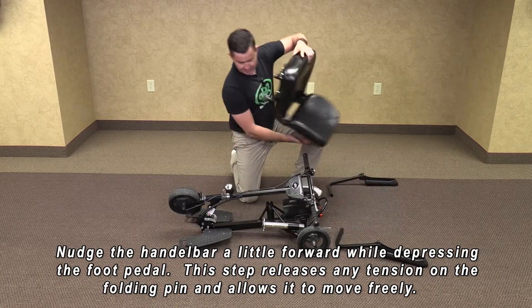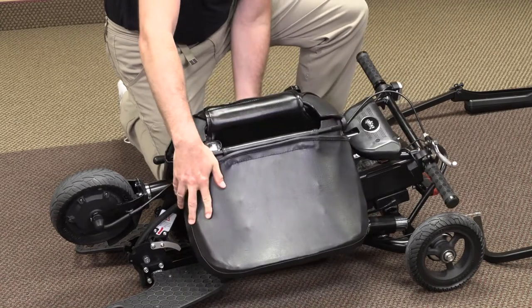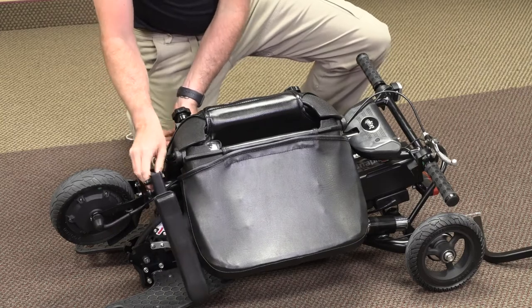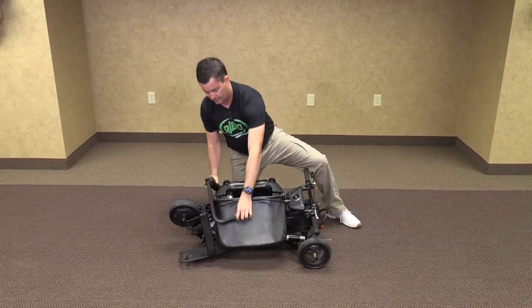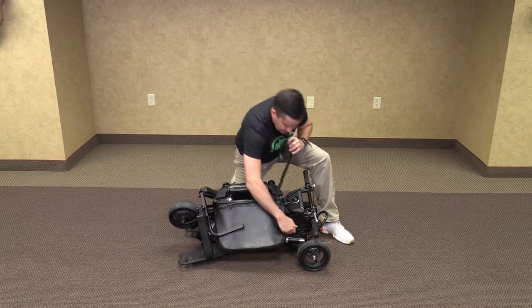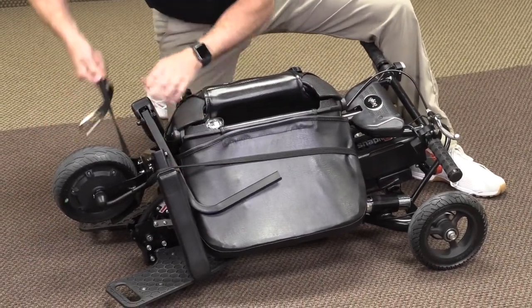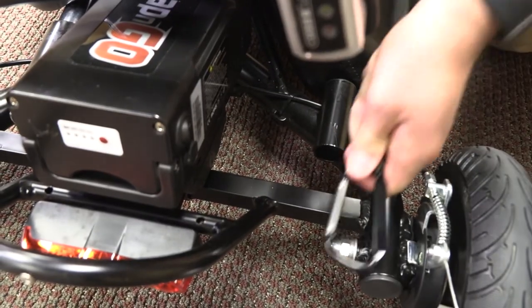Then we are going to take our seat and fold it over the handlebar. Taking our armrests and placing them here and here. Then we take our travel bungee, lock it in place, pull it around the arms and the wheel, and bring it down to lock in place.